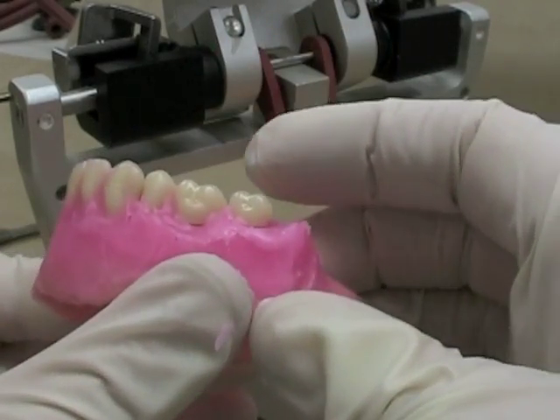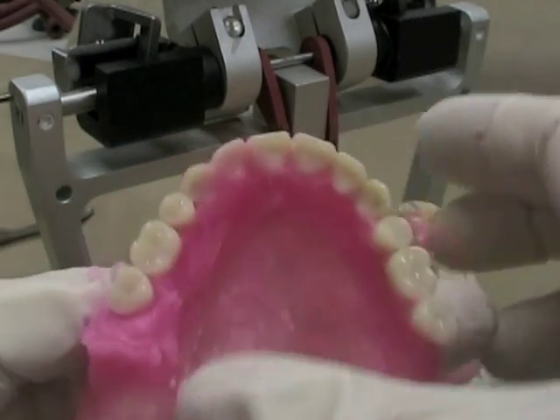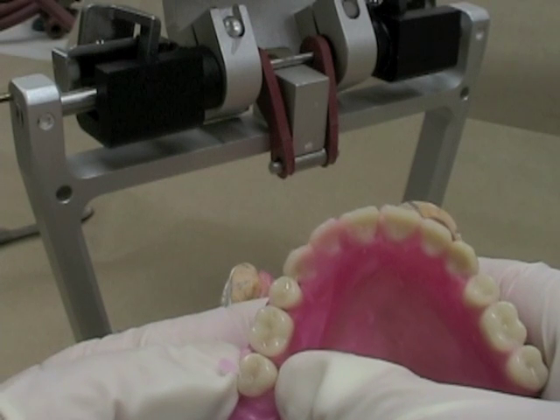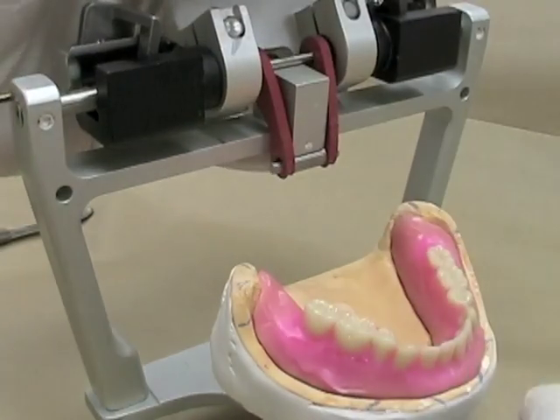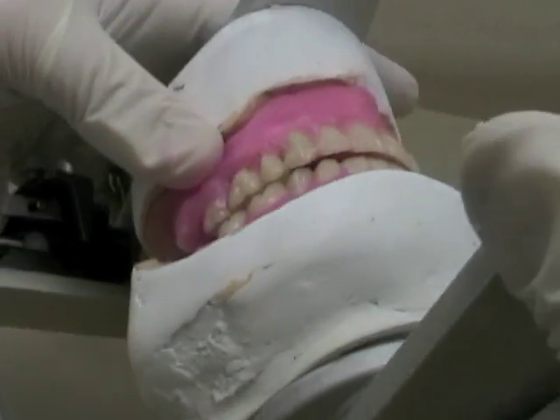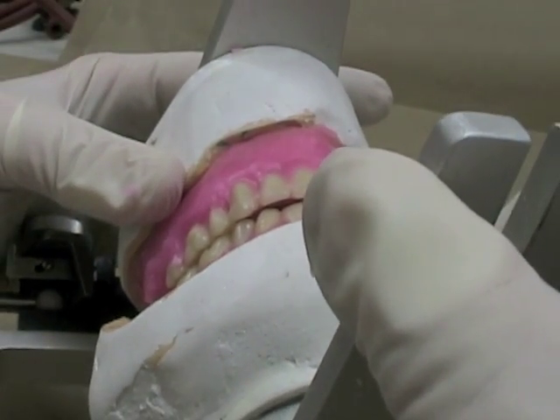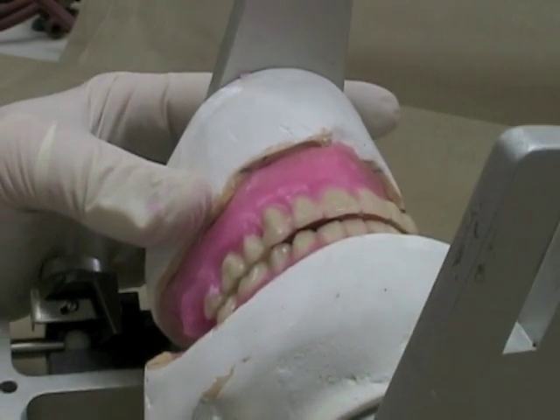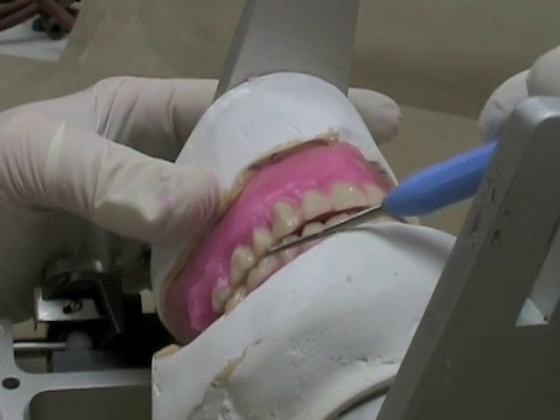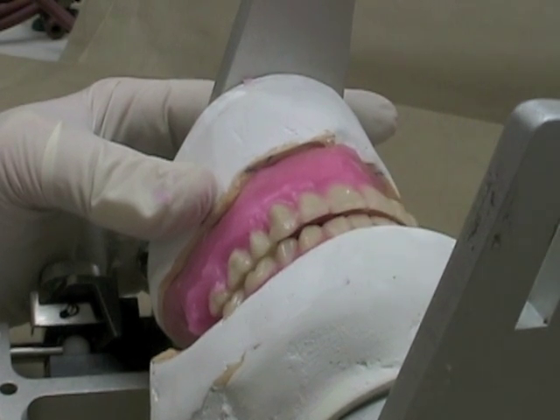Get the occlusal plane approximately right. Move it buccolingually so it looks like it should be in approximately the same spot. Check again to make sure that I have enough buccal overjet and no buccal cusp contacting. If anything, I probably have a little bit too close of contact here, but I've got good overjet on both of my molars.